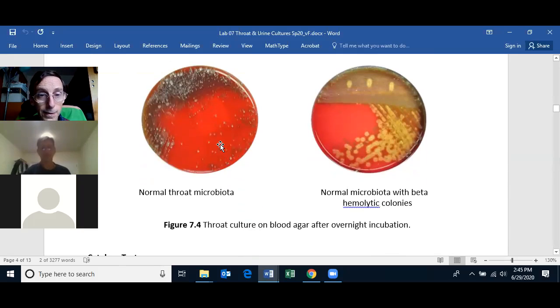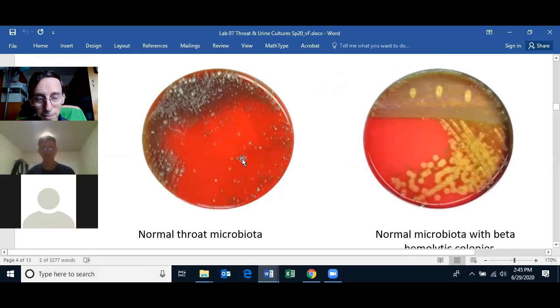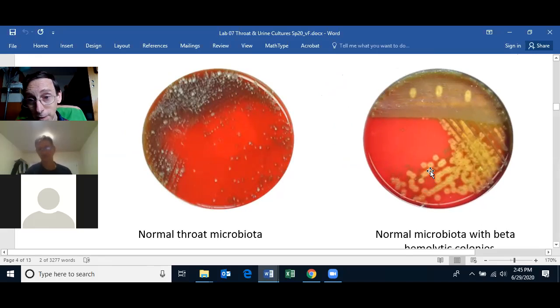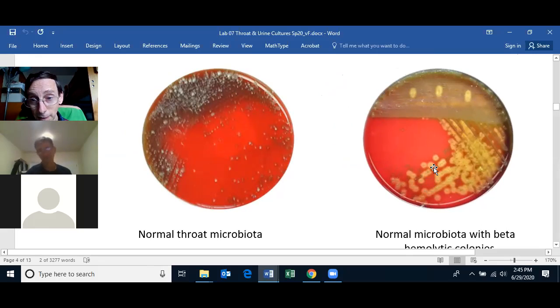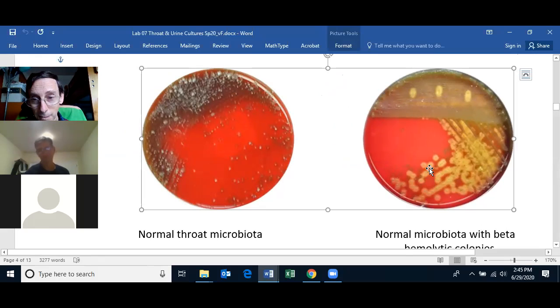Looking at a blood agar plate, you can see mostly no hemolysis. There may be some slight alpha hemolysis, but here you can see complete beta hemolysis — a little dot that is the Streptococcus pyogenes colony and then the large clearing around it, which is the complete hemolysis of the blood in that region.